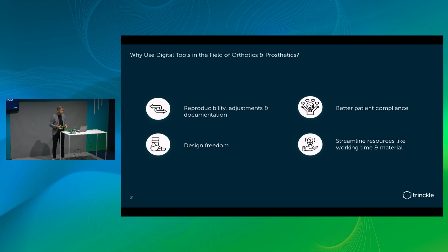Additionally, we talk about patient compliance, a term that I learned anew, but it has to do with the acceptance of such an orthopedic device by the patient. I learned that a couple of decades ago, people tried to hide their prosthetics or orthosis devices as much as possible.